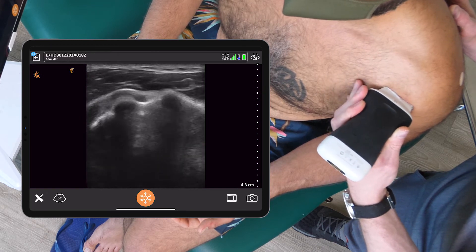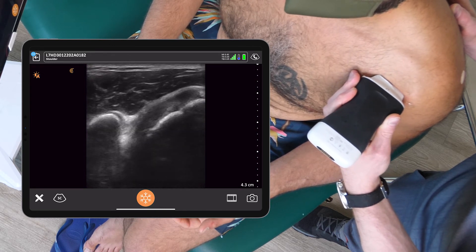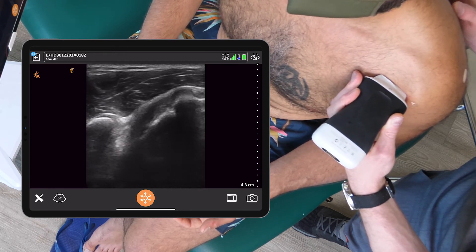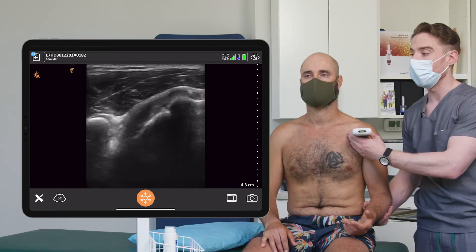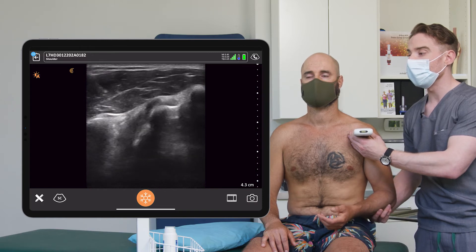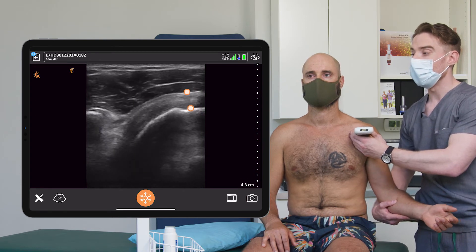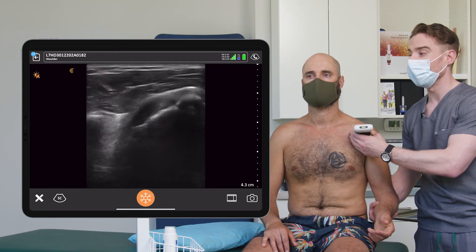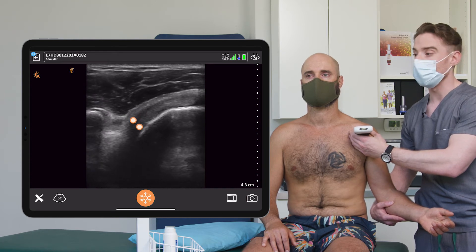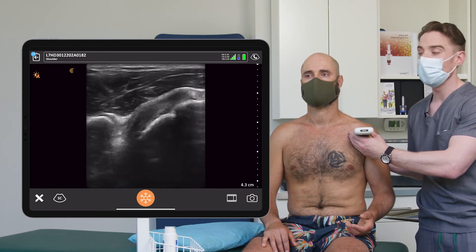Next, we'll move on to the subscapularis, which is just medial to the biceps tendon. Sliding our probe medial, we appreciate the coracoid on the medial aspect of the screen. I'll often tell my patients to externally rotate — I'll give them a hand in this case. We can appreciate the subscapularis tendon moving through its interval adjacent to the coracoid process. This demonstrates the tendon footprint, and as we move out and externally rotate, the aponeurotic tissue of the subscapularis, which sometimes can be a pain generator if there's disruption or thickness of this structure.